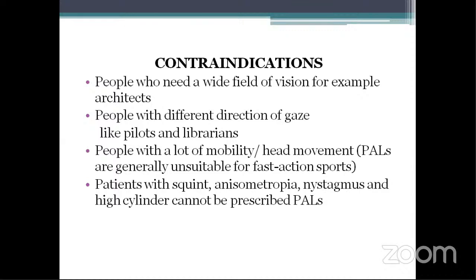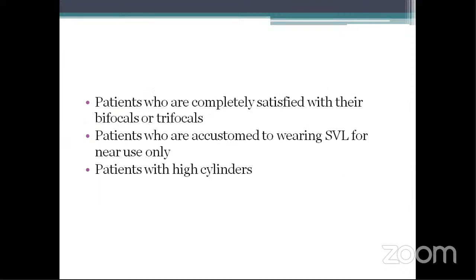People with different directions of gaze, like pilots and librarians. People with a lot of mobility, that is the head movement. Such people are generally unsuitable for fast action sports. Patients with squint, anisometropia, nystagmus, high cylinder cannot be prescribed PALs. And also patients who are regular bifocal or trifocal users and they are completely satisfied with bifocals or trifocals.